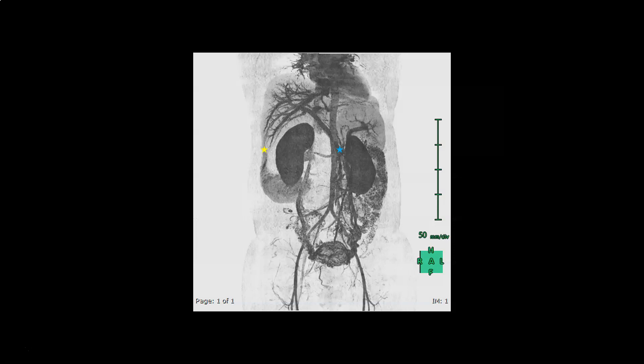Then we see the uterus showing heavy collateral veins passing through the myometrium anteriorly and posteriorly. This is the maximum intensity projection of the contrast-enhanced CT after removal of the bone, and here we see two very important anatomical landmarks.